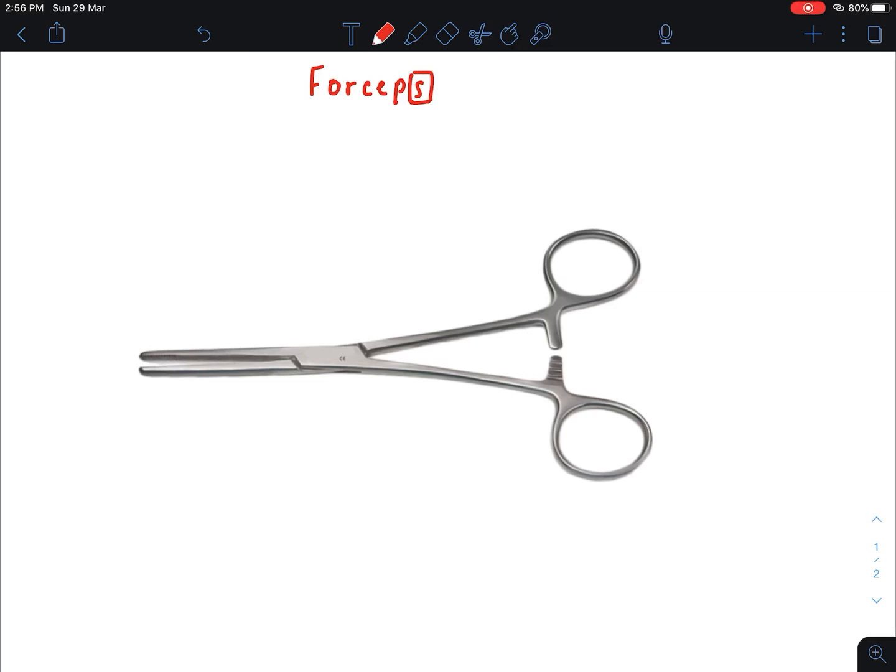Now I want to discuss the parts. You can see this part is known as the tip — this is the tip of the forceps. This part is the blade or jaw. Blade or jaw is the working end of the instrument.